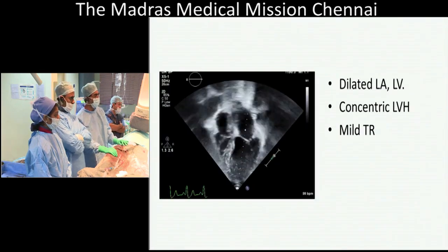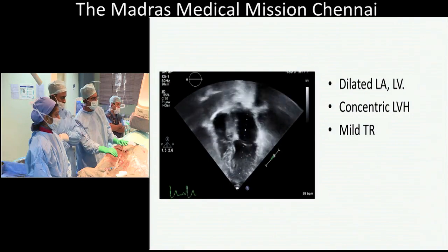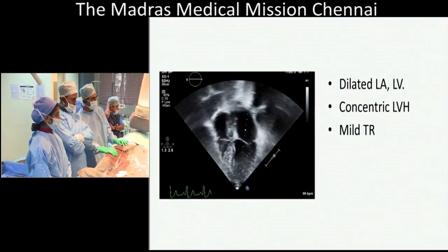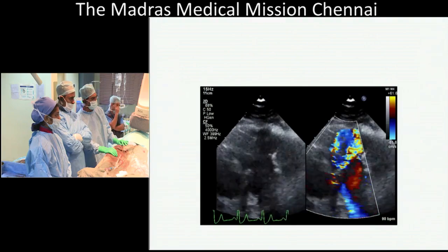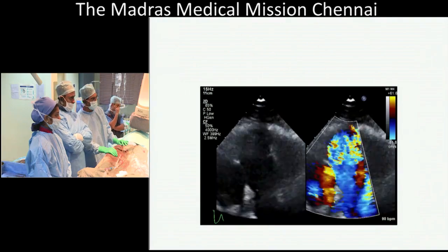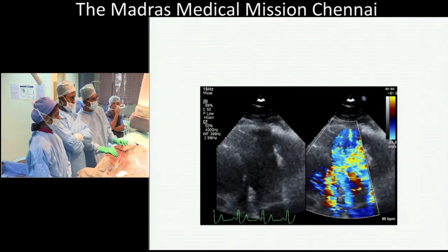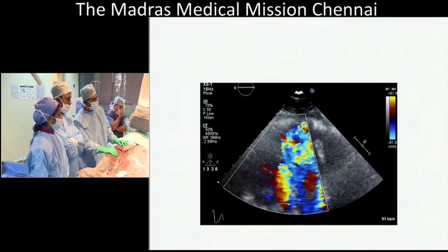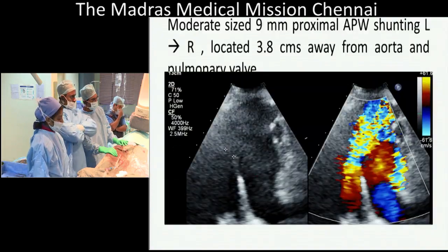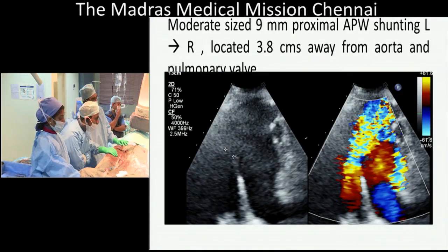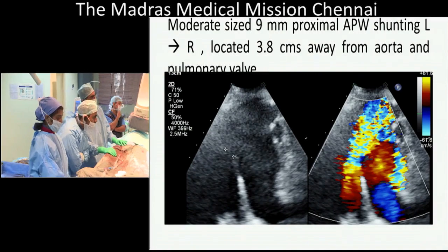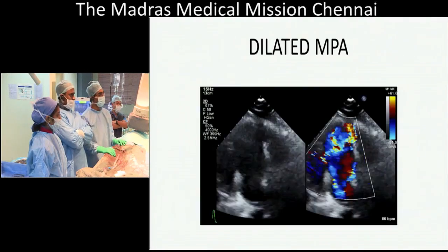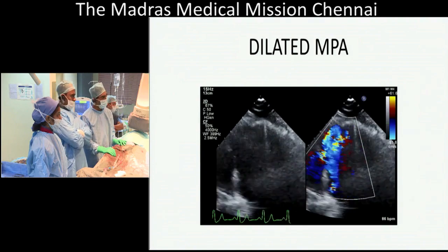These are the echo pictures. This is the 4-chamber view showing dilated LA and LV, concentric LVH and mild TR. This is the short axis view showing the aortopulmonary window — a moderate size 9 mm proximal aortopulmonary window shunting left to right, located 3.8 cm away from the aortic and pulmonary valves. This is the dilated MPA segment.